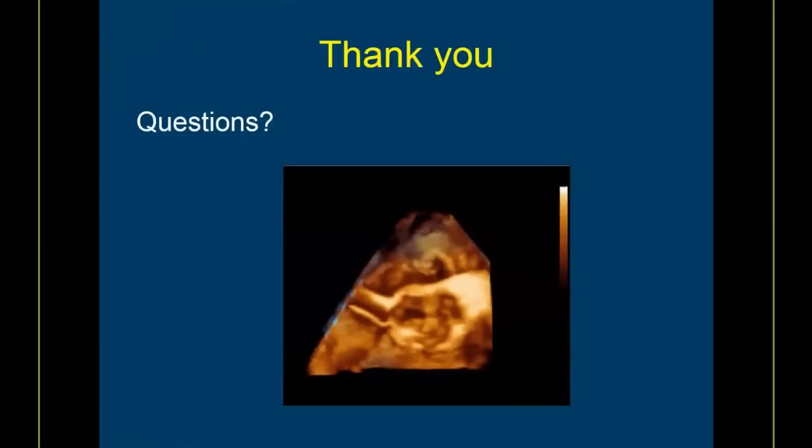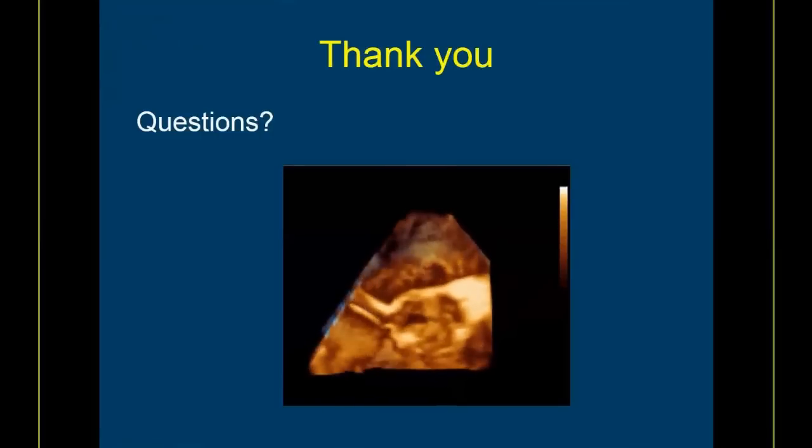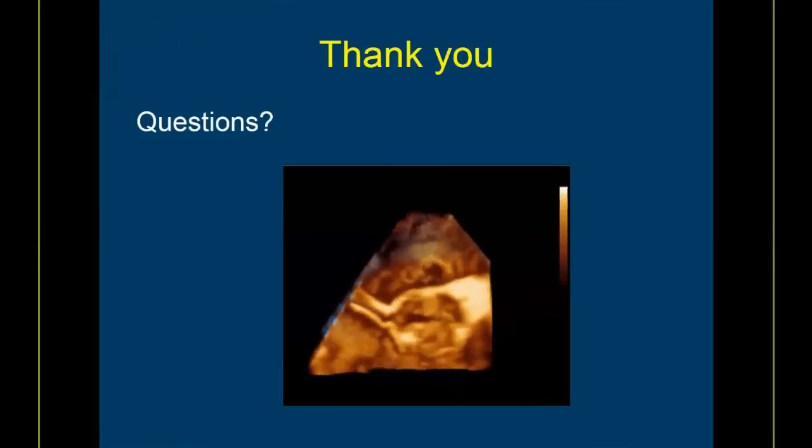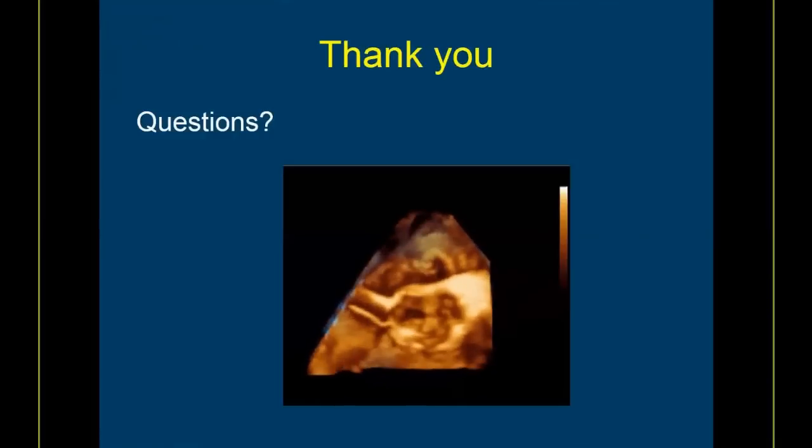So oftentimes what I'll do is simply report a LVOT/aortic gradient. And I don't calculate an aortic valve area in that case because if you don't have laminar flow in the LVOT, then you can't use the continuity equation. So I'll often just report that there is stenosis in series because there's a discrete subaortic membrane and valvular aortic stenosis, or a dynamic LVOT obstruction from the presence of HOCM. And I'll simply give a gradient that encompasses them both.